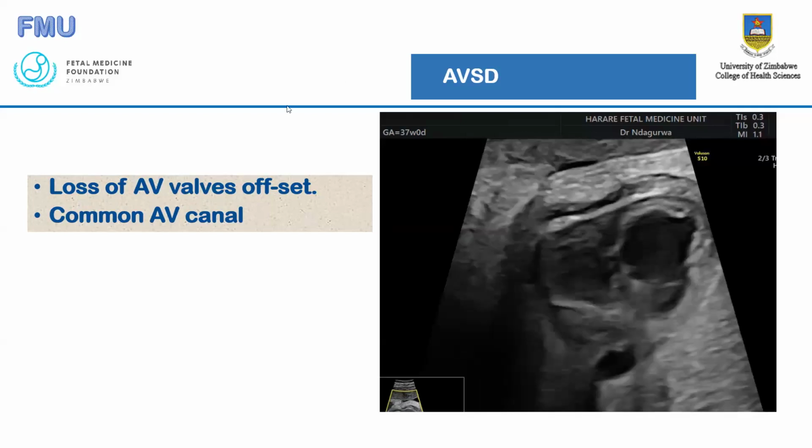Guys, I need answers. I'm waiting for comments to hear what people think. There is a 4-chamber view there. Let's get some takers.